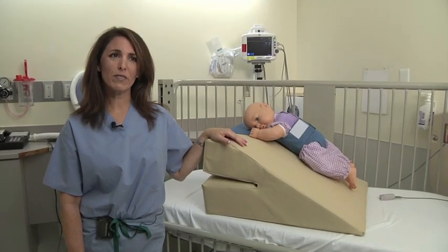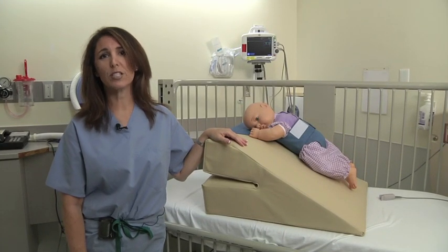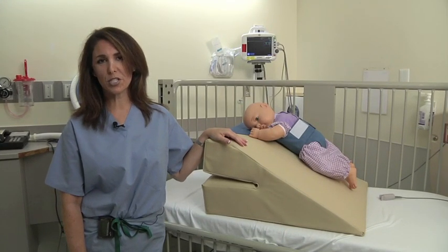We're going to talk about how to achieve the best use of the rescue wedge in the prone or tummy lying position.